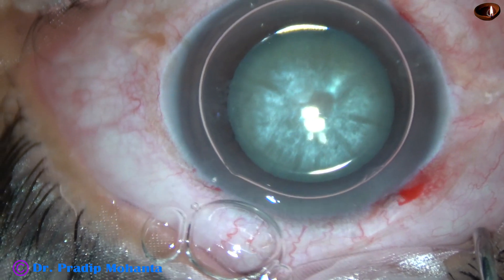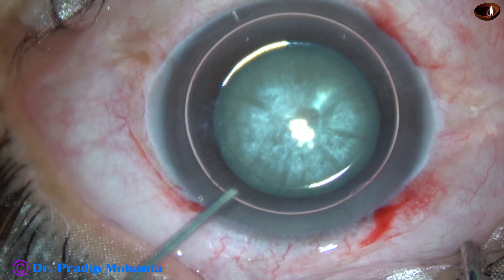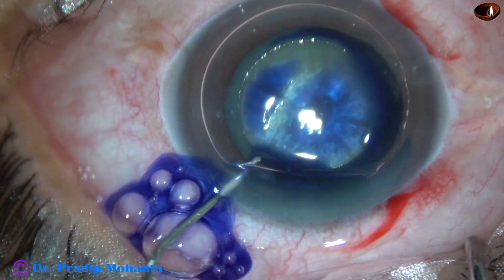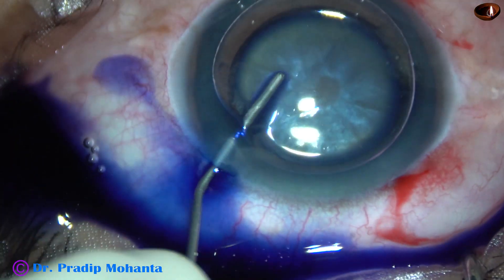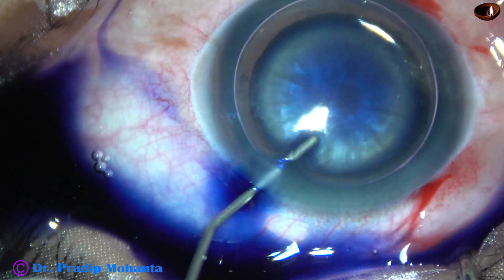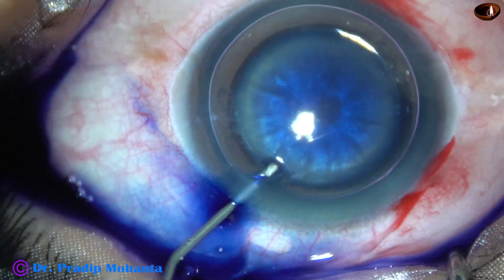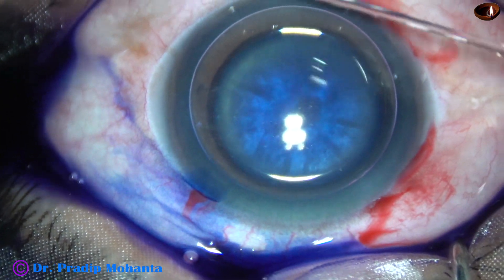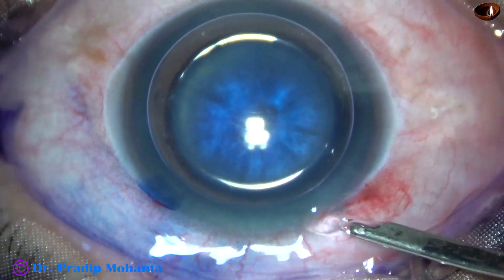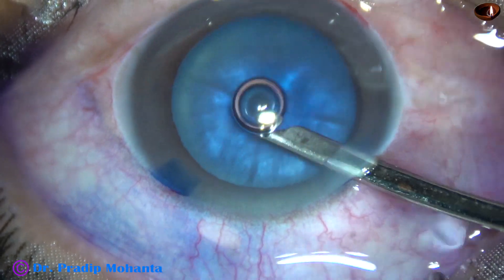An air bubble is injected, and beneath this air bubble, trypan blue dye is applied over the anterior capsule of this white cataract. Just after applying the dye over the anterior capsule, the dye is washed out with BSS and a Simcoe cannula.